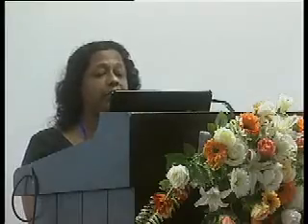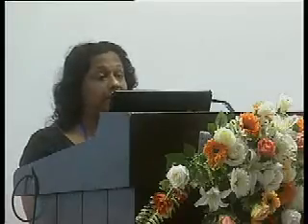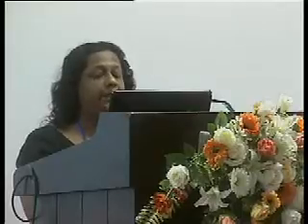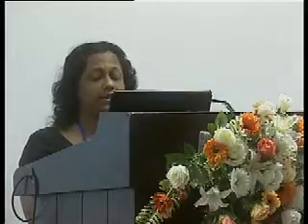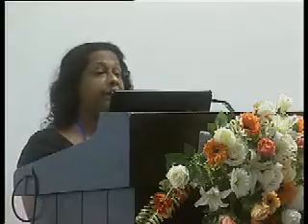An in-house RID technique was adapted in the Department of Biochemistry at the National Hospital Sri Lanka in 2002. I am one of the authors. It is for the detection of microalbumin in 24 hour urine preserved with 100 milligrams per liter sodium azide. The established method was used to determine the urine albumin concentration in the range of 5 to 200 milligrams per liter. The major drawbacks of this adapted in-house RID method were the difficulty in performing a single test at once and the lengthy, tedious 48 hour laboratory analytical phase.